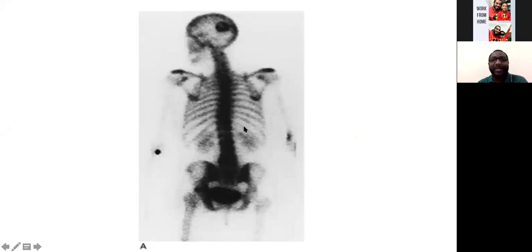Again, remember that most of our patients will have come with their diagnosis. So the idea of interpreting a bone scan is not to make a primary diagnosis, it is to help in staging the patient, to detect the presence or otherwise of a skeletal metastasis.